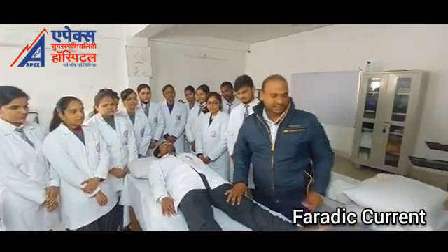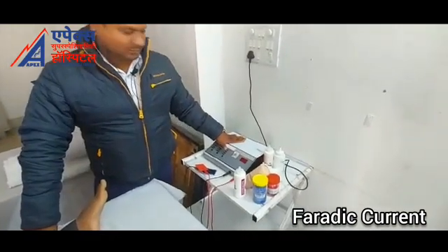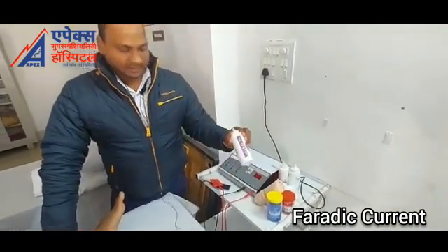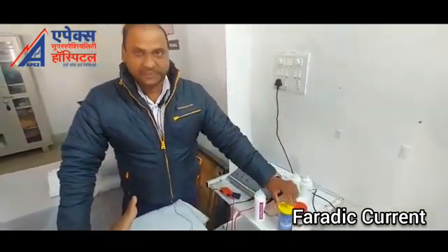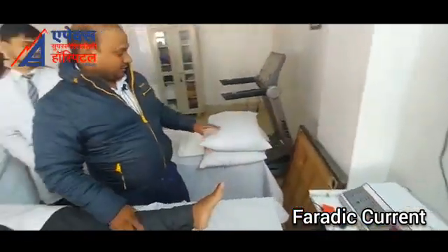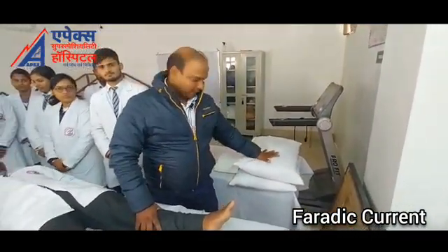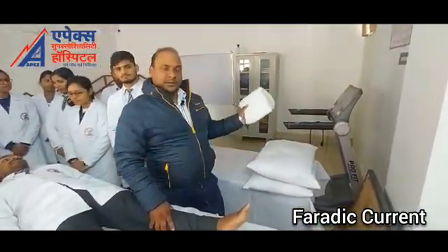Firstly we see the instrument. Here is our instrument — this is a muscle stimulator, the ultrasonic gel, the crepe bandage, cotton, and also some more things included for this: that is the pillow for the elevation of the lower limb, and the towel.